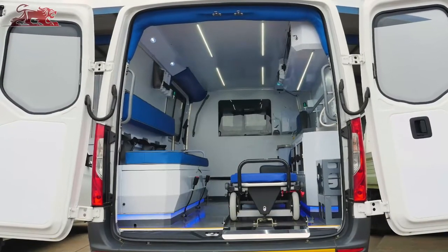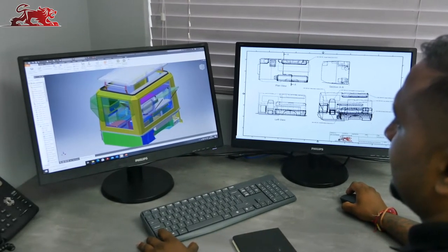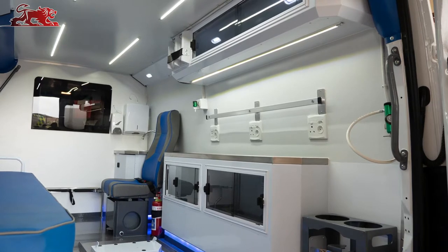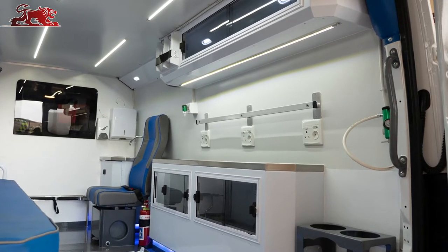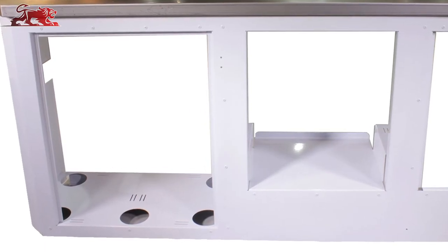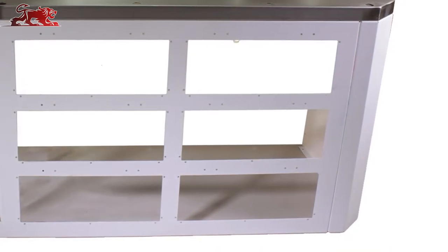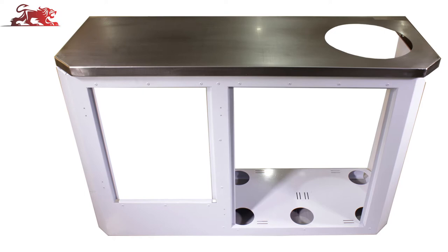Modular designed internals using the latest CAD technology for precision fitment. Stainless steel cabinets and storage facilities custom engineered for patient and crew comfort and safety. All manufactured components are either powder-coated or surfaced with a sophisticated coil coating to ensure an easy-to-clean and hygiene-friendly environment.